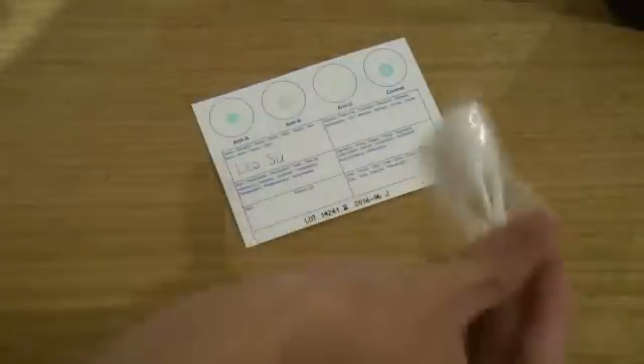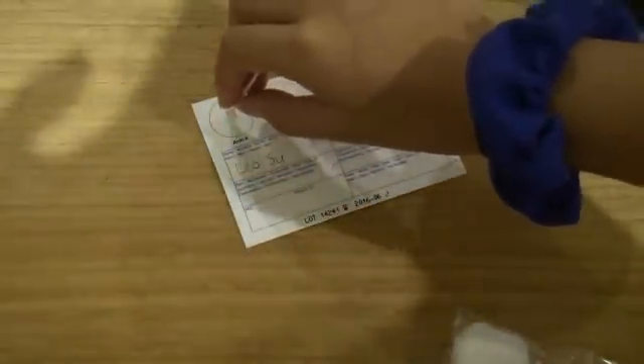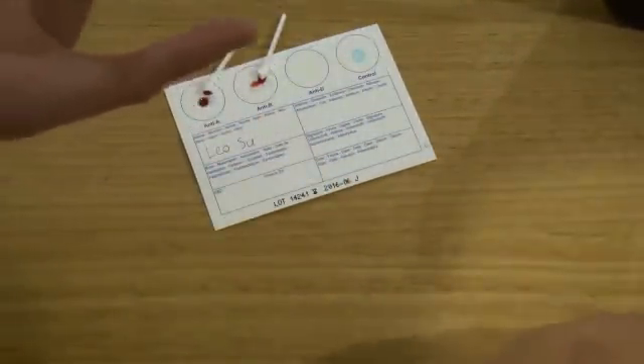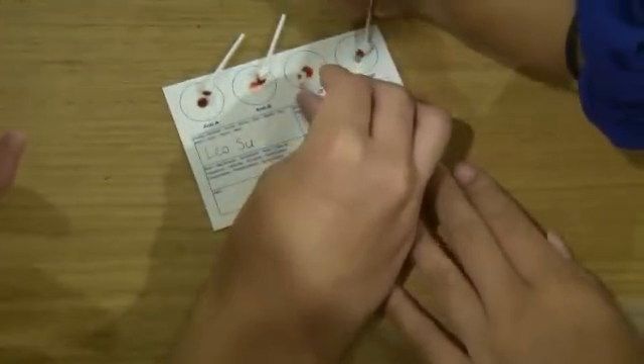It says hold it. Now you collect one of the Eldon sticks — I have my assistant here, click, my sister. Collect it and place it into the first circle and leave it there. Have to be quick. Make sure you don't use the cotton swab that they use to wipe your blood.